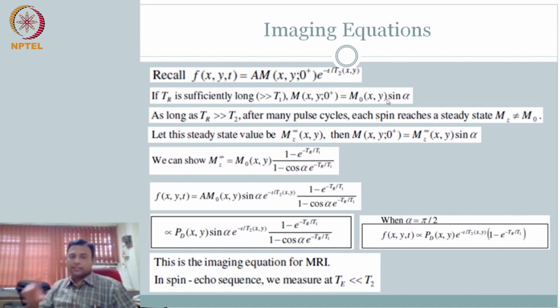But notice here, this is good. Whatever we have covered so far is good when you do it once. There is an important concept that we will reveal now. What we want to do is repeat it again and again and again, right? That is, this is your magnetization vector. I am pushing it to the transverse plane. Again, it comes back. Again, I am pushing it, repeating the experiment with different settings, right?